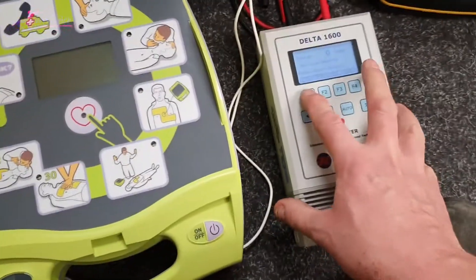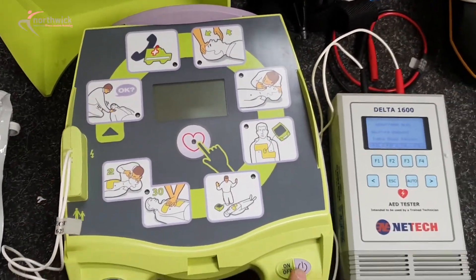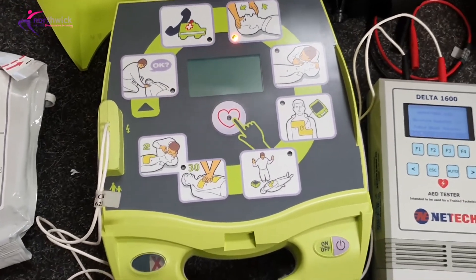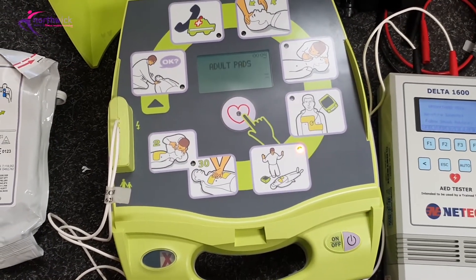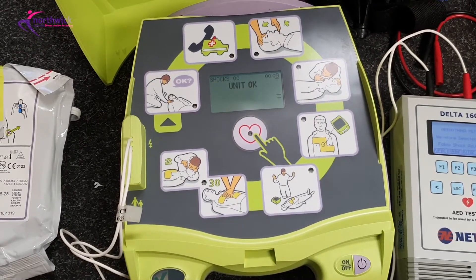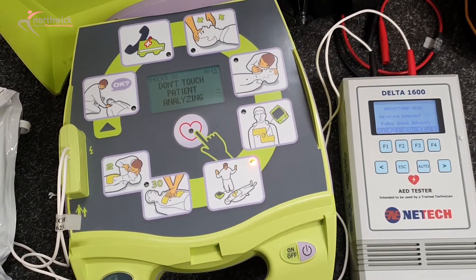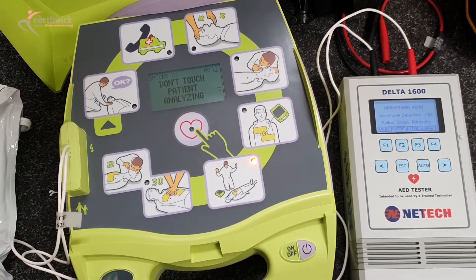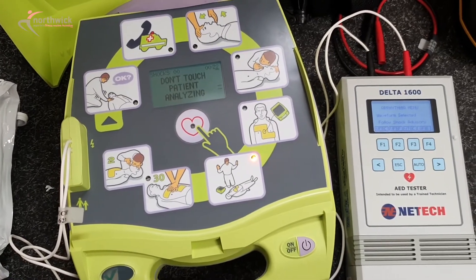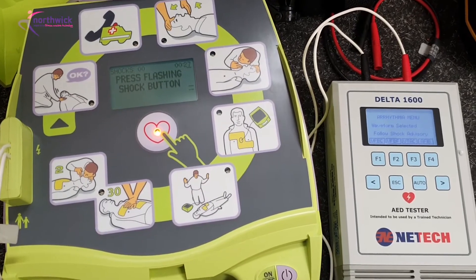Same routine: set it onto an arrhythmia pattern that would require a shock. This is a working device — I'll just turn this on. Adult pads, this is the self-test routine. Don't touch patient, analyzing.